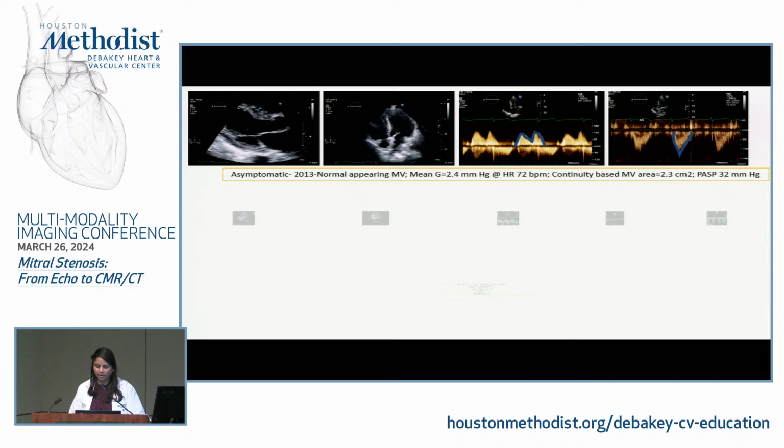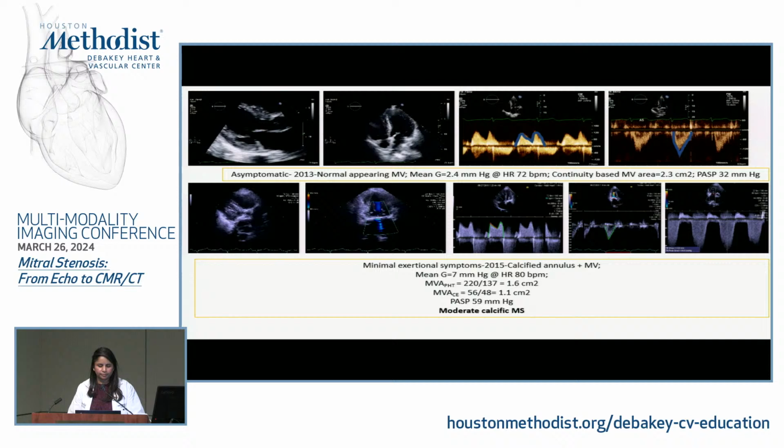Now the patient comes back in 2015 and you start seeing this. You have some minimal exertional symptoms. You start seeing that the annulus is getting calcified.